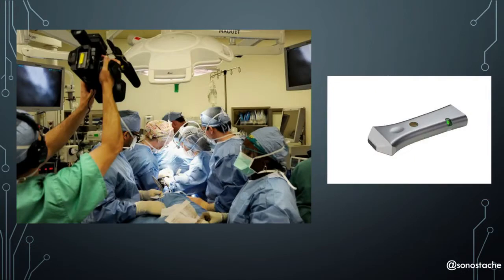What about the trauma rooms they're now rebuilding? Like a big room, still we seem like we don't have enough space to squeeze the ultrasound machine there. So what if you have your wireless probe, you walk in there and you're scanning, and you have TV monitors right there, and you're displaying the anatomy and all the pathology? Fantastic, right? That's what we need, instead of taking the big cart rolling in between the patients, and trauma surgeons sometimes love them, sometimes hate them. Then you have to apologize for things. Only if you have the handheld device, that would make your life easier.